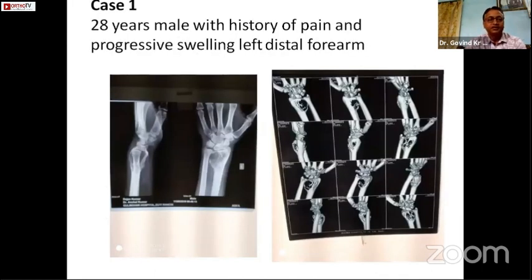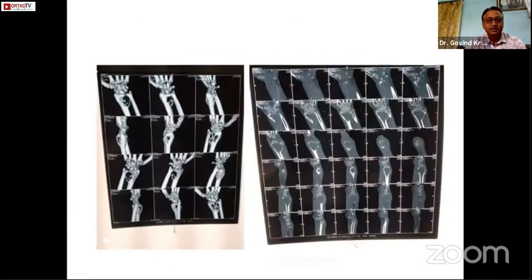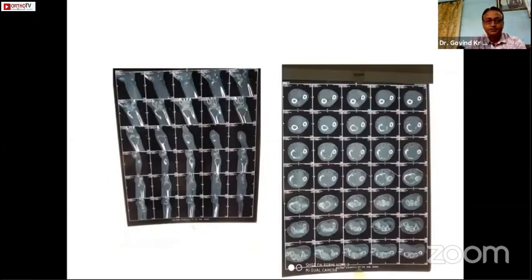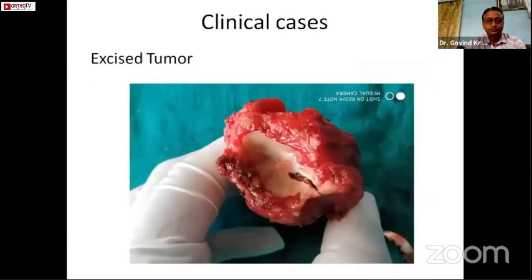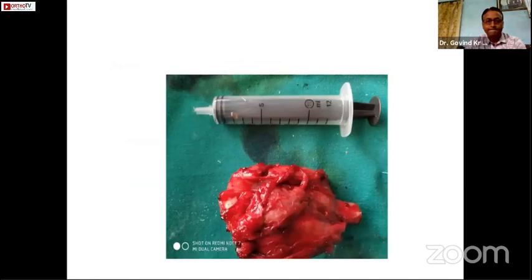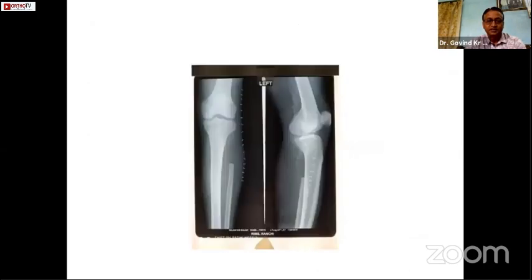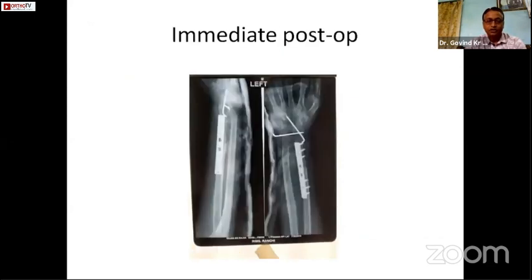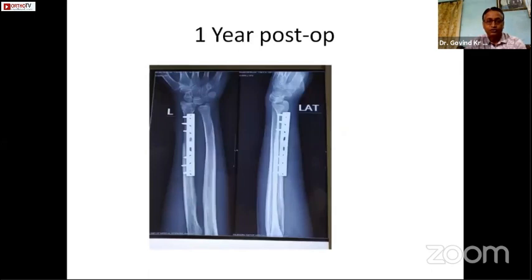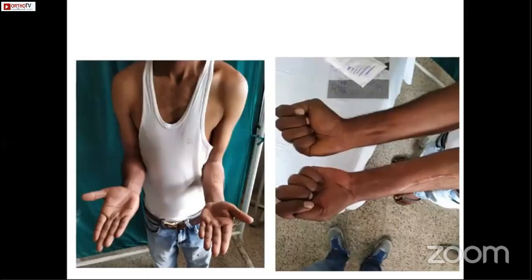The first case is a 28-year-old male with a history of pain and progressive swelling in the left wrist. These are the pre-operative X-rays. This is the 3D CT scan showing that the lesion has broken the cortex. These are the CT scans, the excised tumor mass, and intraoperative views. This is the graft harvest site. Immediate post-op and 1-year post-op follow-up images show the functional range of motion of the wrist.